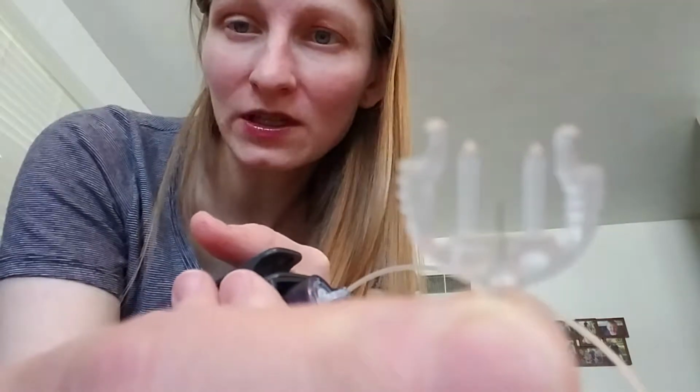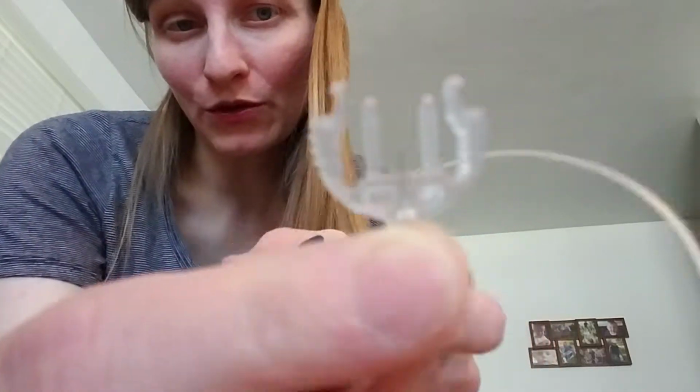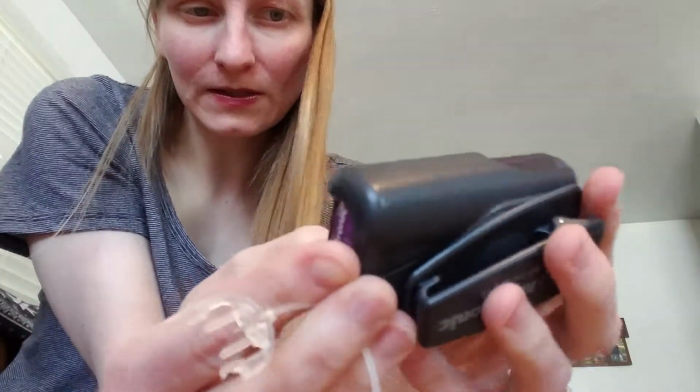It's kind of like a mini IV, so it's a little plastic tube basically that goes into my skin that I have to change every few days. And this goes into that to push the insulin through the tubing, out this needle, into my infusion site, which goes into the little cannula that's in my skin to give me the insulin. It doesn't have to go into a vein, it's just into the skin.